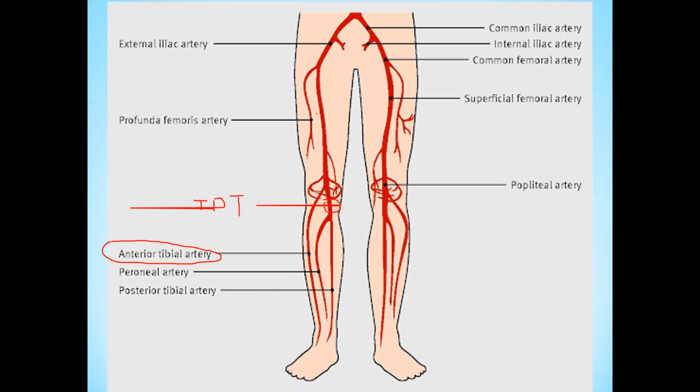For the lower limb arterial and venous examination, the patient should lie supine on the examination table, and the transducer should be placed at the inguinal region, transverse, just below the inguinal canal at the inguinal crease. This is the region where you should place the transducer.